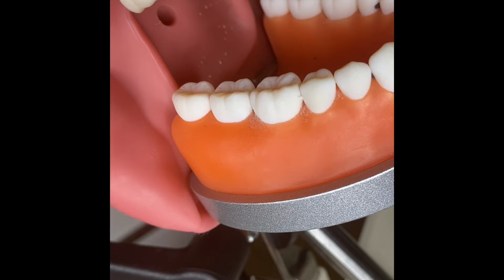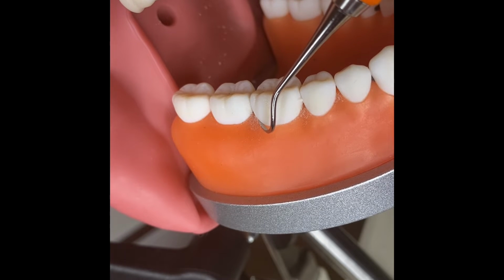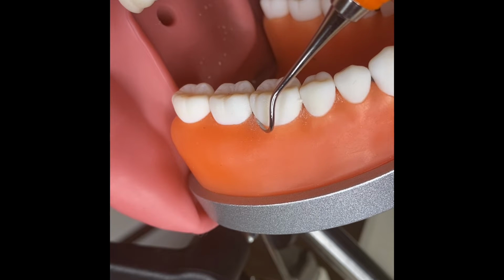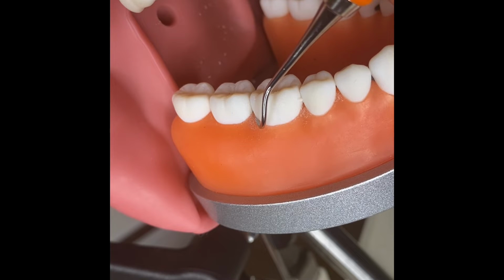So I'm starting at the distal line angle at a 45-degree angle positioning. I'm starting side to side, side to side, pivot, roll, side to side, pivot, roll, up, down, down.